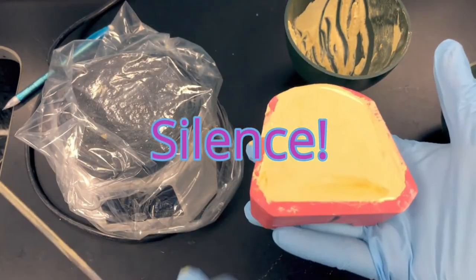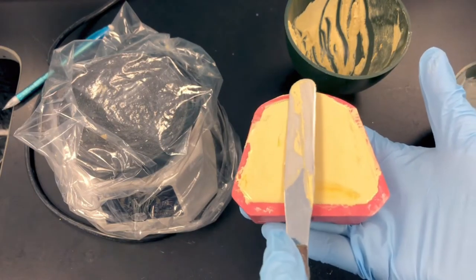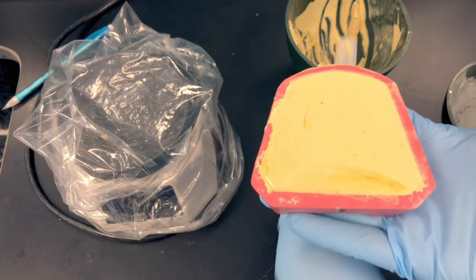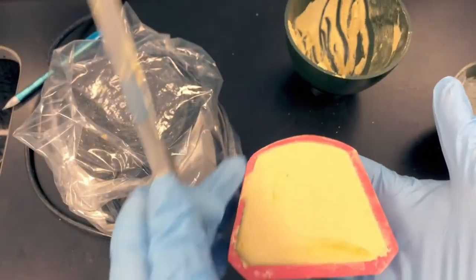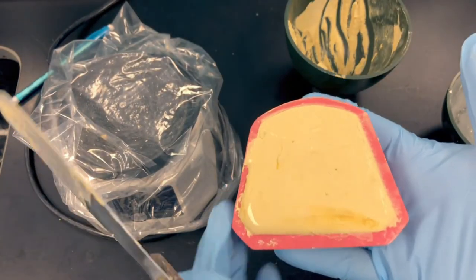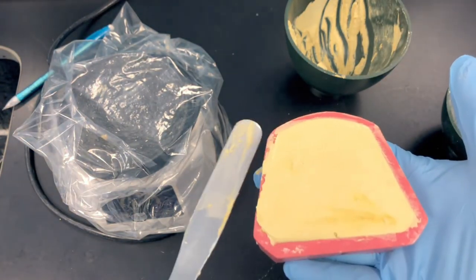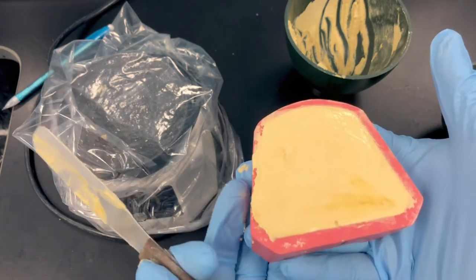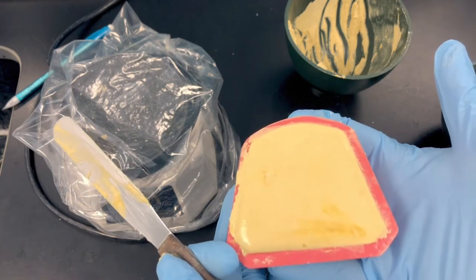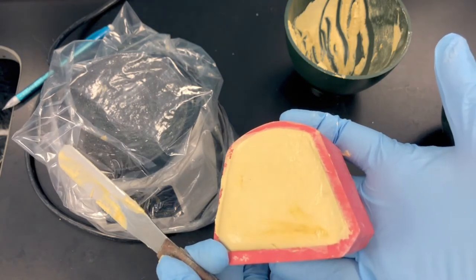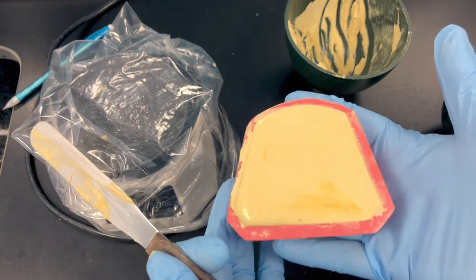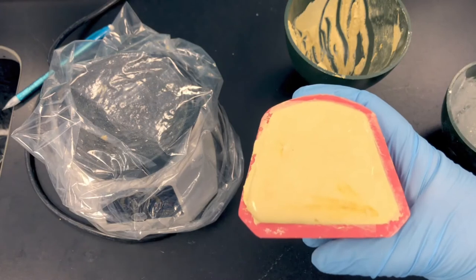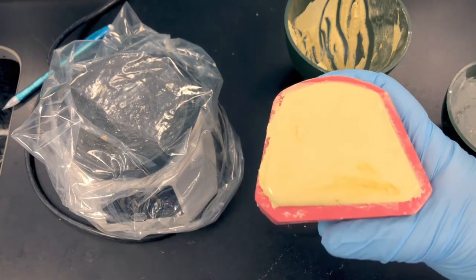This is similar to a box and pour method. If you have an impression and you choose to use some boxing wax to create a border around the impression to contain the stone, you're effectively pouring up the anatomic portion, the teeth and tissue, and the base portion at the same time. This will take about 45 minutes to set up, so I'll set this off to the side and I'll make a new mix for the other arch.